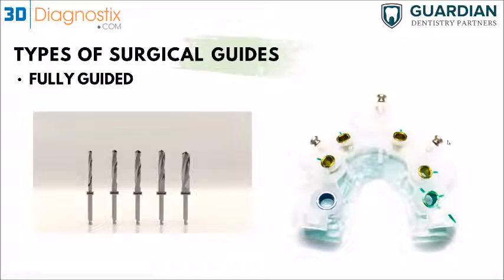And that also is another picture of the drilling guide placed on top of the bone reduction. So in this scenario, you're going to be placing the bone reduction in first, reducing the bone, and then once you've done that, you're going to just have the drilling guide stacked on top of it using those magnets, and then drilling the osteotomies and placing the implants in.